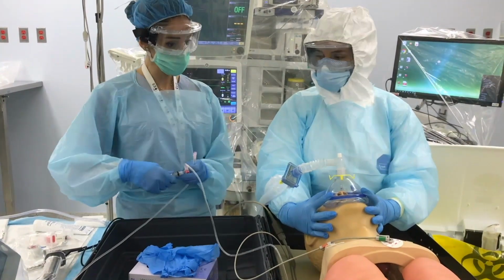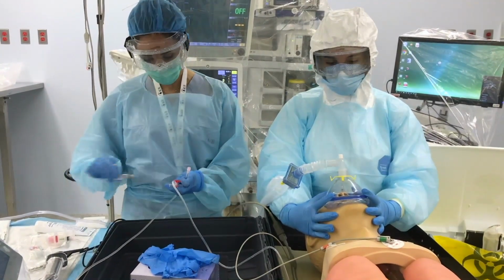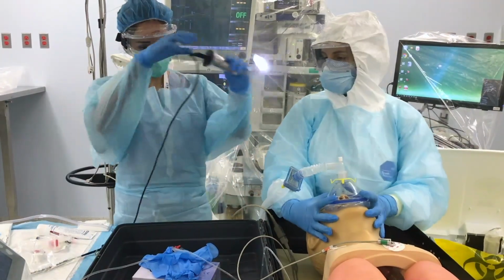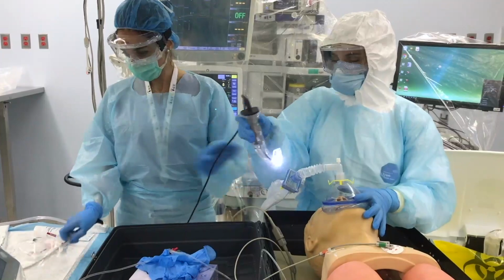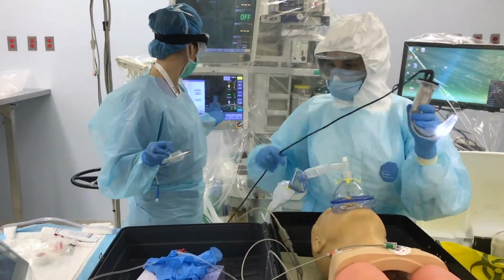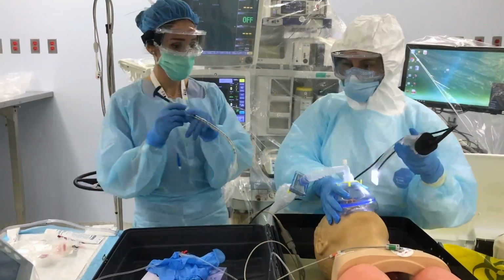Your medications are in. Once you're ready to intubate, we're going to pause the gas flow. I'm ready. I'm going to hand you this. And we're going to prepare the tube. And the gas flow is paused. You can go ahead.